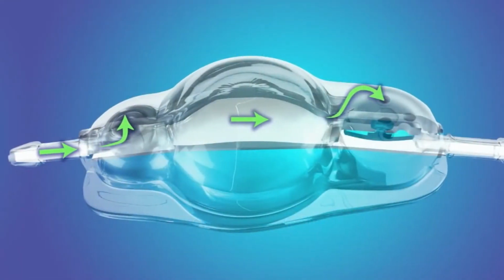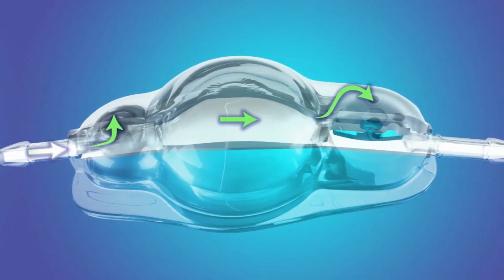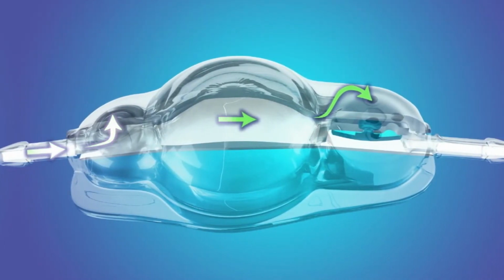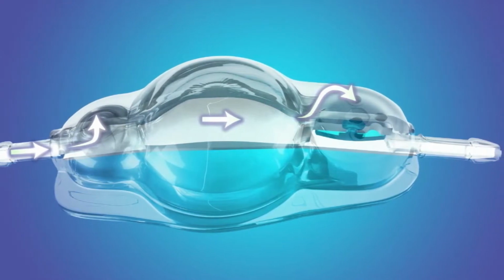As CSF flows through the contoured valve, it enters the inlet connector, flows by the proximal occluder, and into the central reservoir. For sampling CSF, the reservoir dome can be accessed using a 25 gauge or smaller non-coring needle. From the reservoir, CSF flows through the valve mechanism flow holes.